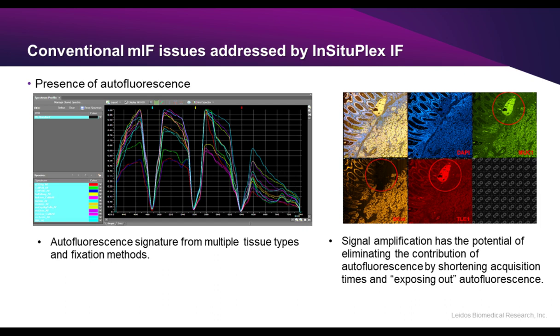Thank you. Now, is there a problem with eosin autofluorescence interference when multiplexing on an H&E slide? Great question, and I think maybe I wasn't as clear as I should have been for that part, but when we actually run the eosin, the H&E of a multiplex fluorescence slide, we basically run our multiplex fluorescent assay first, capture that image. Once you're satisfied with that image and that image quality, then we would run the eosin, the H&E, afterwards, and then acquire your bright field image.